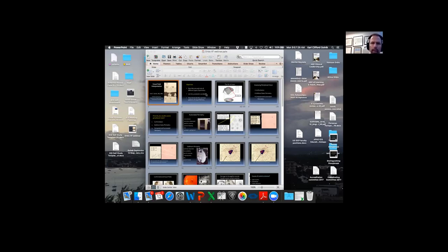The question is about non-edge points to consider in 30-2 only or also in 24-2. I'm not really sure what is meant by non-edge points. Certainly, if you order a 24-2, you're missing the temporal field, superior and inferior, beyond 24 degrees. So could you miss a field defect out there? Sure. Most of my glaucoma specialists' standard tests are probably 30-2. For neuro-ophthalmology, I'm looking for patterns, and so a 24-2 I think is adequate. I'm not sure that answers your question.